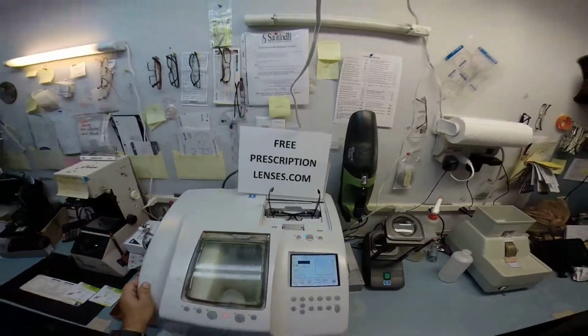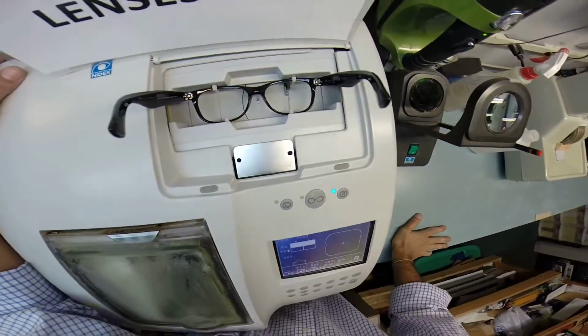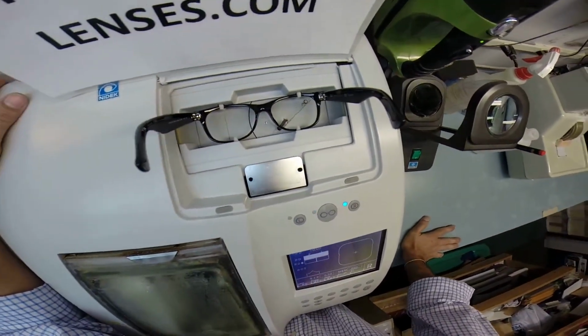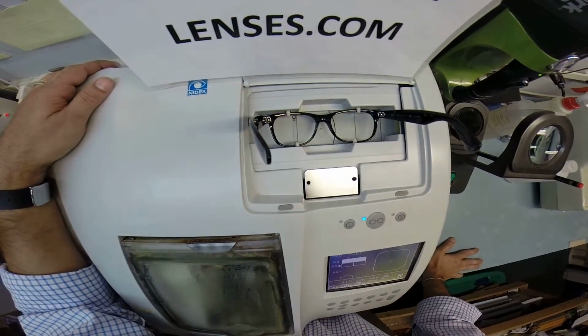So the first thing I'm going to do is put your frame into my $30,000 Santinelli. This is the LE1000 patternless edger. And the stylus has popped up and is tracing the shape of your right lens, and that's going to move over and trace the shape of the left.